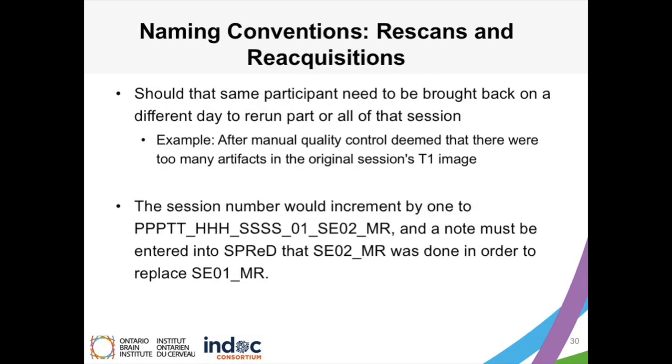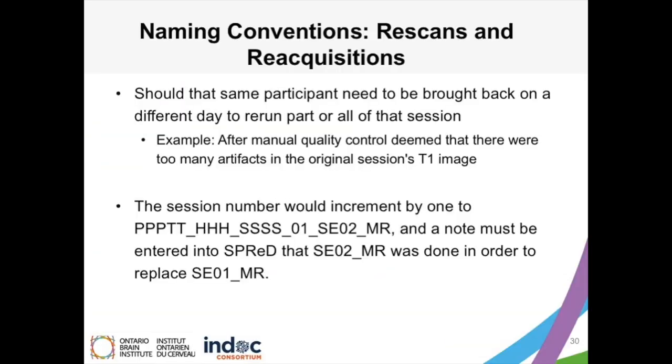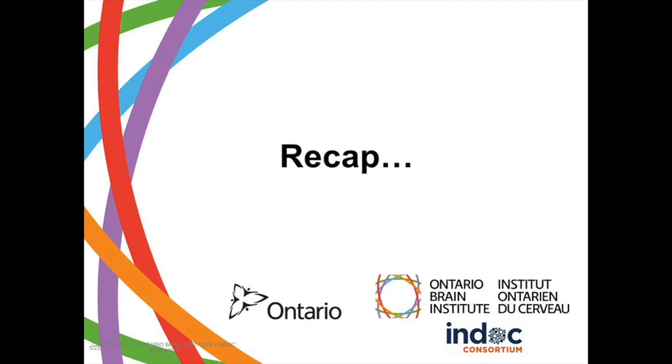If rescans or reacquisitions need to occur after a session has already been completed and the participant needs to be brought back on a different day to rerun part or all of that session, then the session number would increment by 1 to become SE02, and a note would be written into SPReD that SE02_MR was done in order to replace SE01_MR. Let's recap today's training module.